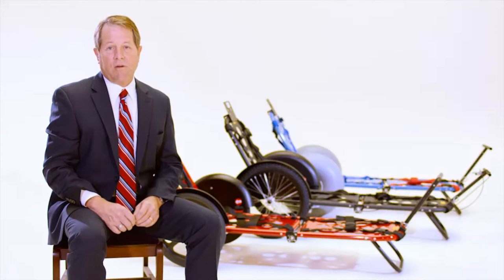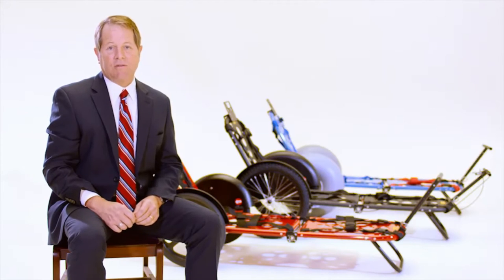The Rex was developed first and foremost to save lives. We here at Rex believe the best way to save lives is through innovation. The Rex is that innovation.